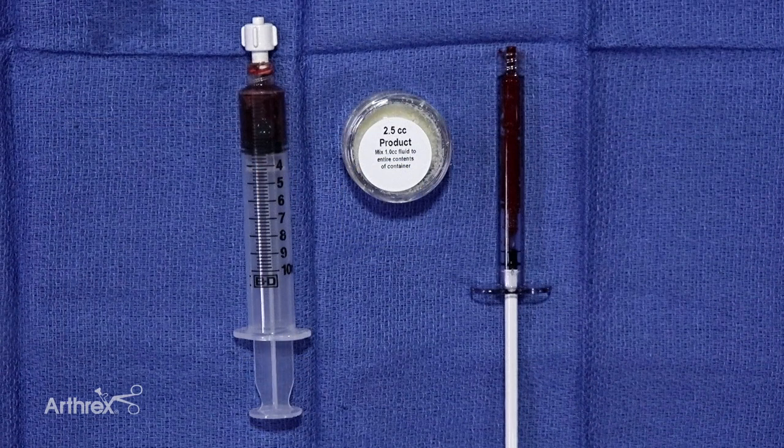What you'll do is combine those two components, and you'll ultimately have a yield that is now a flowable construct in a cc syringe. We will then advance this through a Tuohy needle both at the fracture site subperiosteally as well as within the intramedullary canal.